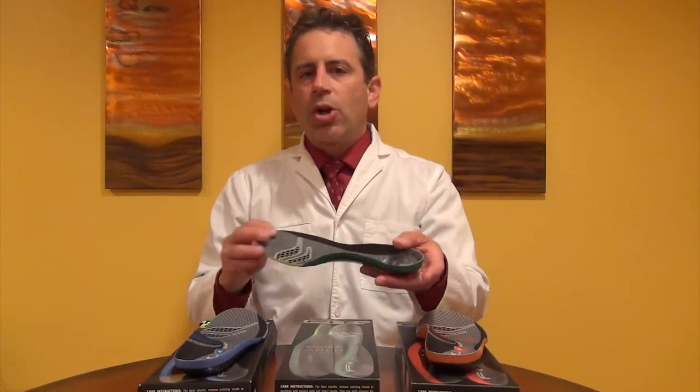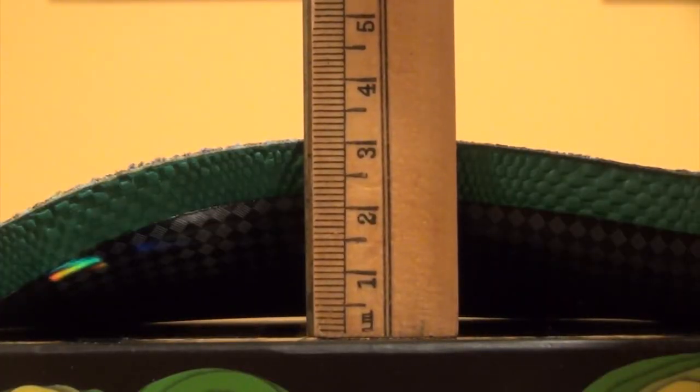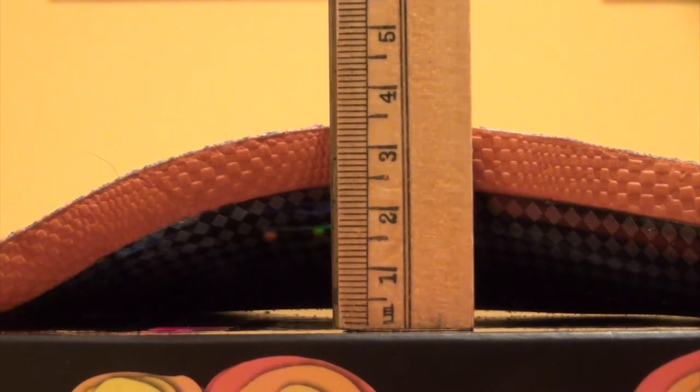The low arch insert is blue and it measures 2.8 centimeters in height. The neutral arch insert — probably a better word would be medium, not neutral — measures 3.0 centimeters in height, so it's a little higher than the blue. And then the high arch insert, which is the orange insert, measures 3.3 centimeters in height.